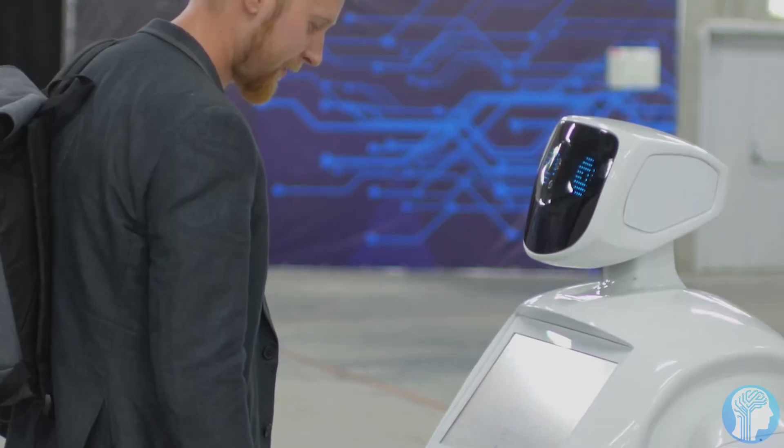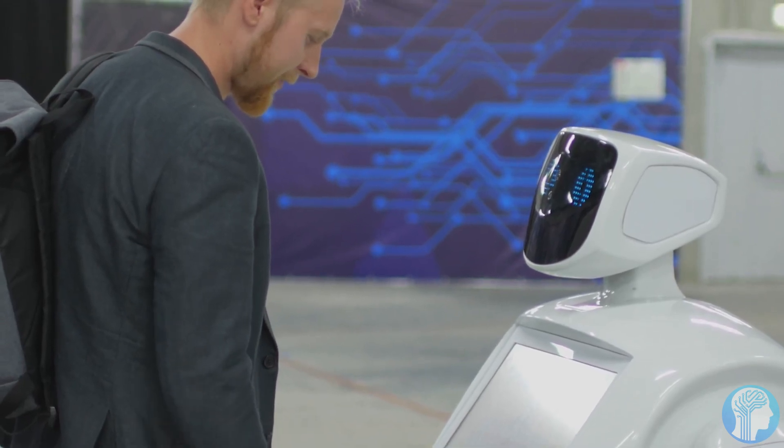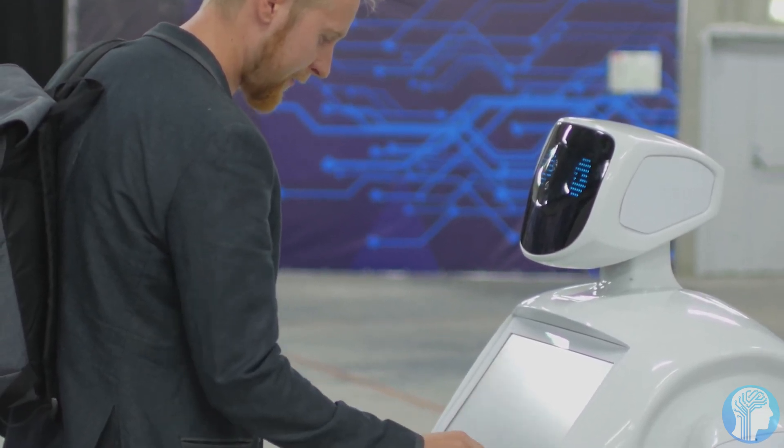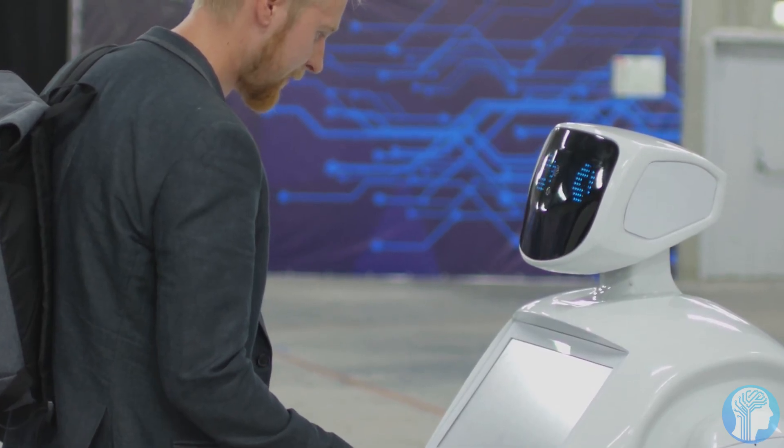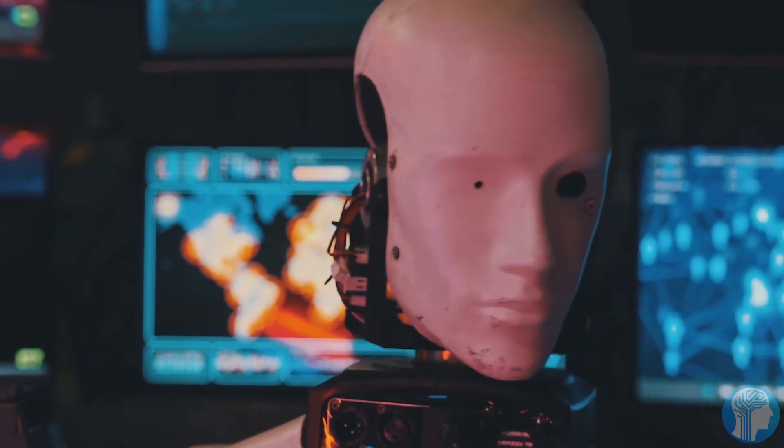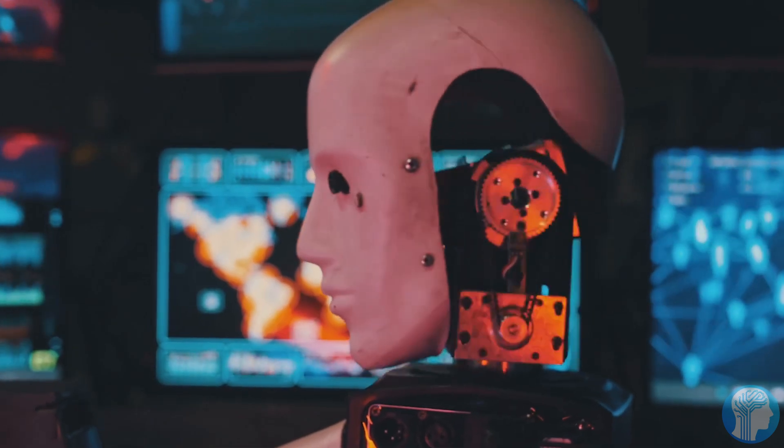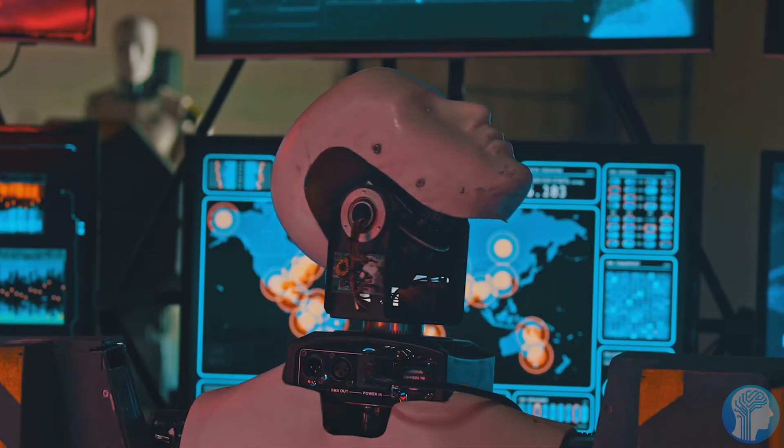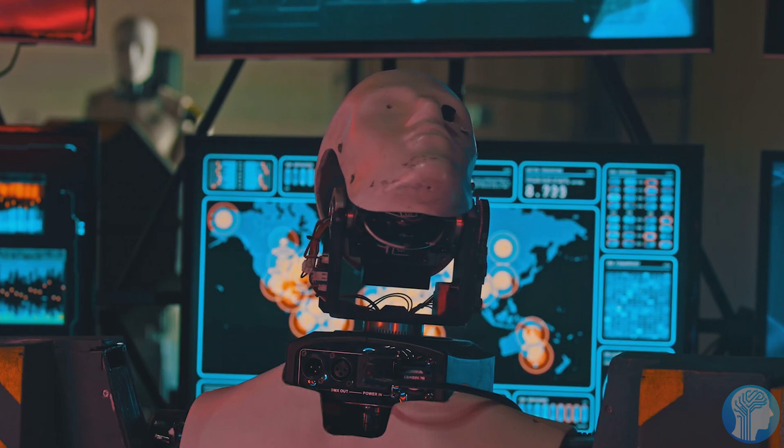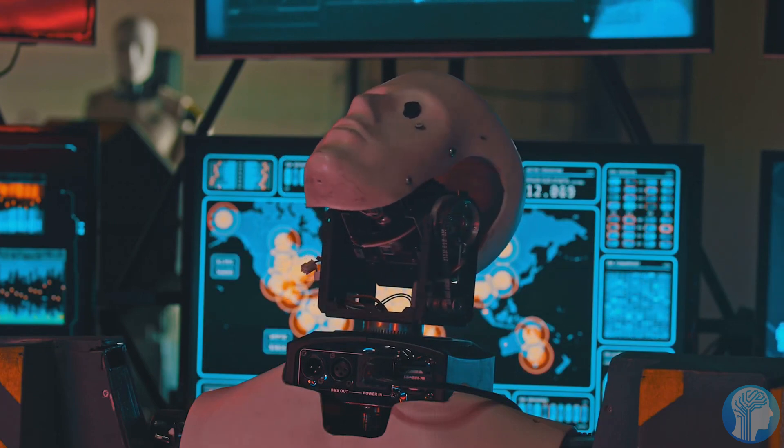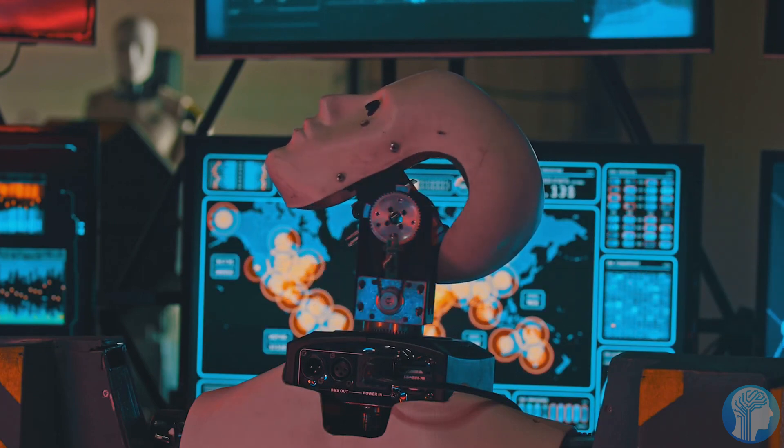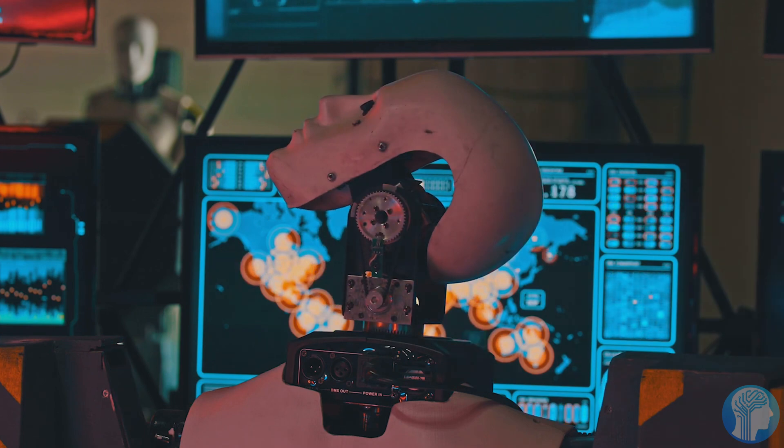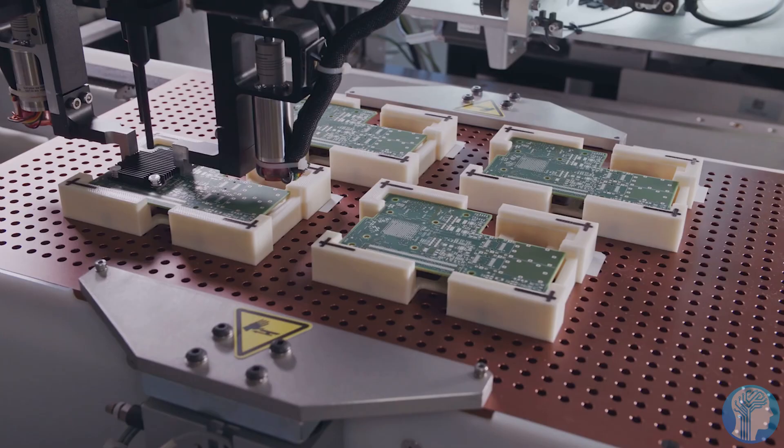As we look ahead, the combination of 3D-printed prosthetics and BCIs could redefine our perception of disability. No longer would amputees be limited by the constraints of traditional prosthetics. Instead, they could embrace a future where their artificial limbs become extensions of themselves, blurring the line between man and machine. The fusion of cutting-edge technologies is unlocking a new chapter in human augmentation, offering hope and possibilities for a brighter, more inclusive future.